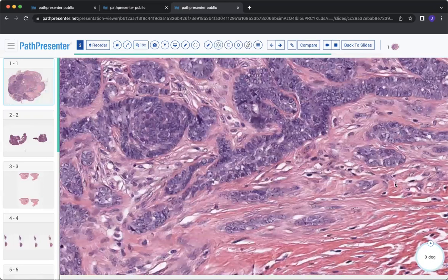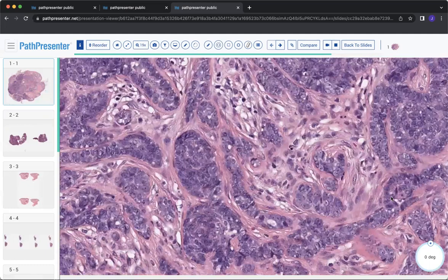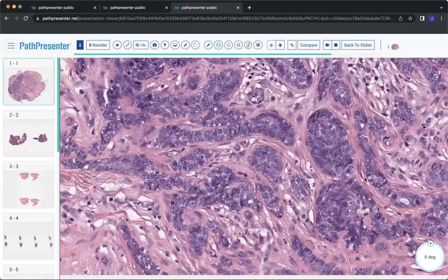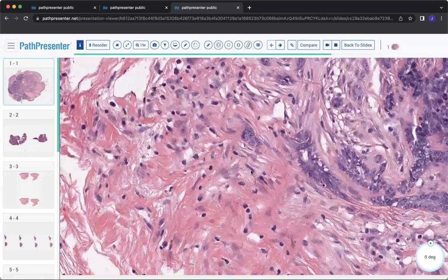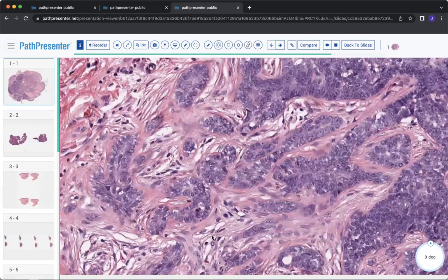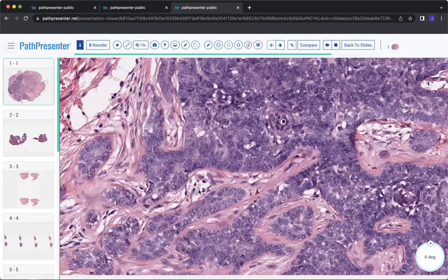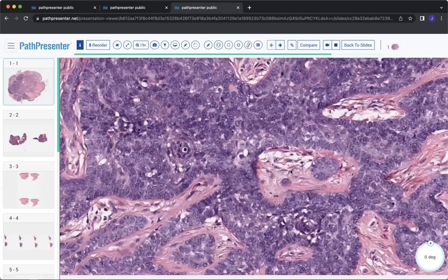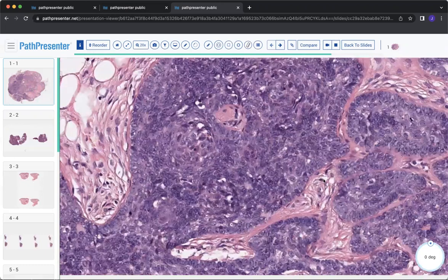And so if you think about ways that you can differentiate between a basal cell and a trichoepithelioma, that same factor of not a lot of retraction is going to play a huge role. So you can see as you go around on high power, there's not a lot of retraction directly between the stroma and the tumor. It's very tightly adhered.